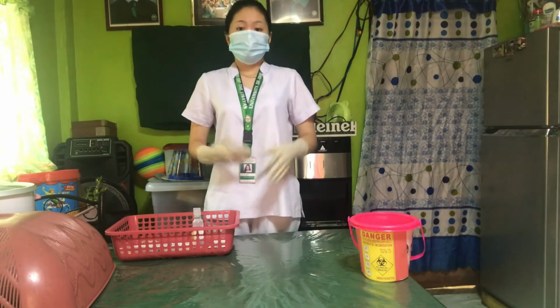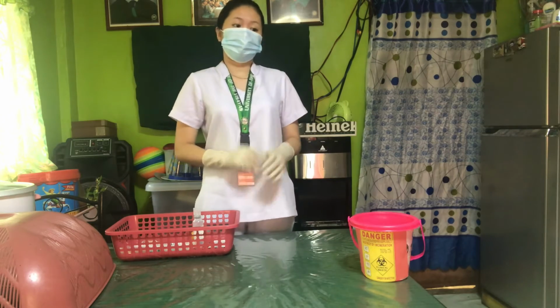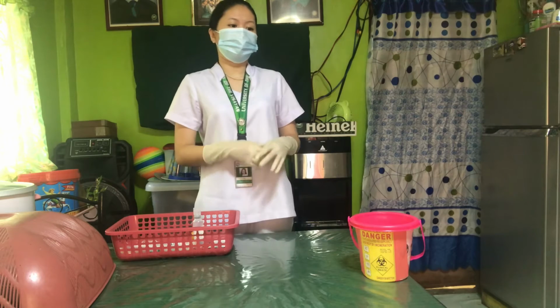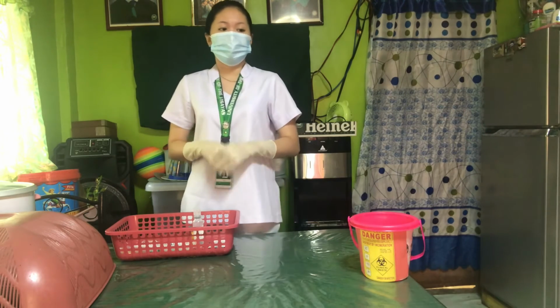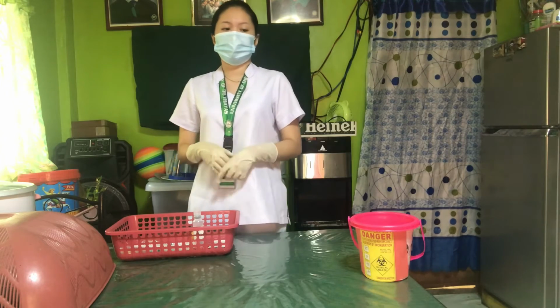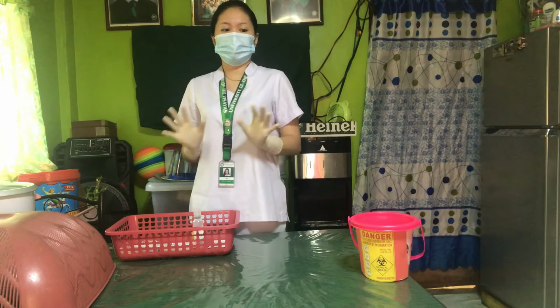So now let's proceed to preparing medications from vials. So the first step is perform hand hygiene and observe the appropriate infection control procedures. This is to prevent contamination and possible transmission of microorganisms. So I've already washed my hands and I've already done my gloves.